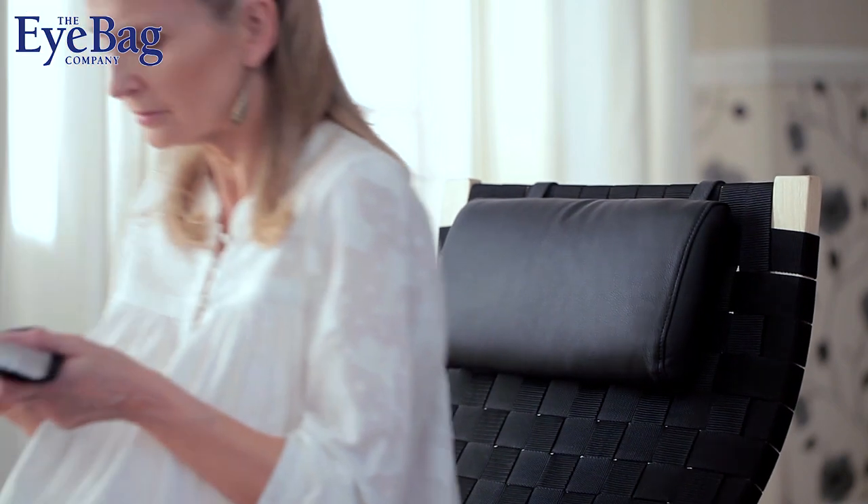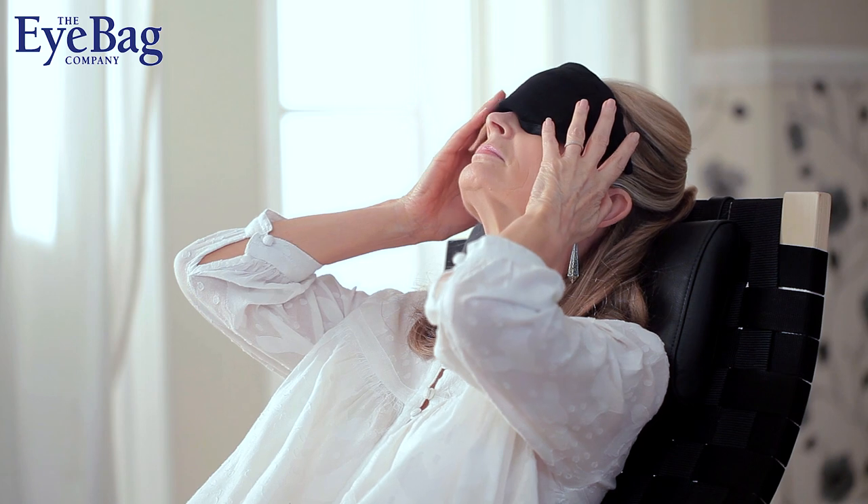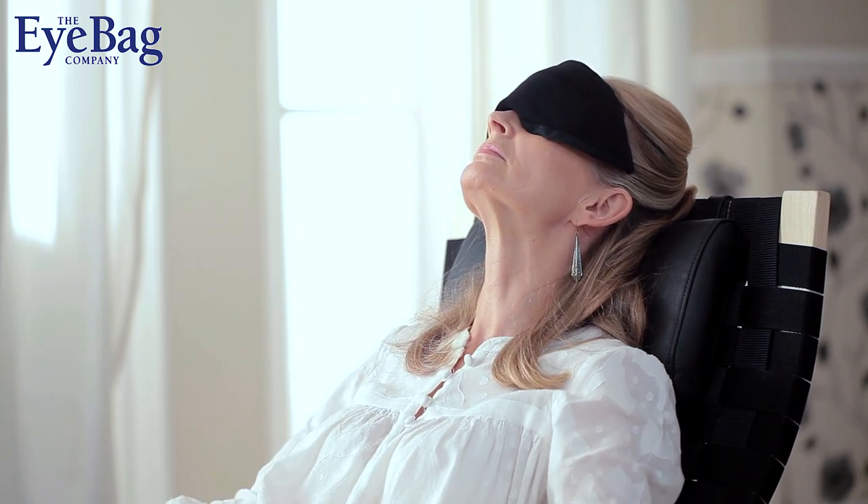Lie back in a comfortable position and place the eye bag over your closed eyes. You'll immediately feel the warmth. Leave it in place for 10 minutes.